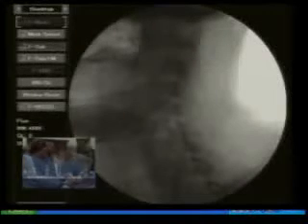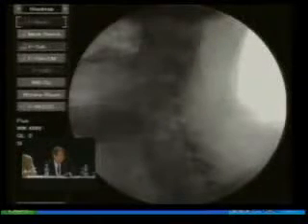Okay. And you would think it'd be more difficult to navigate in that there. It's not. Both of these devices are well made, and they're both nice and floppy, and so you can get them around a difficult arch.